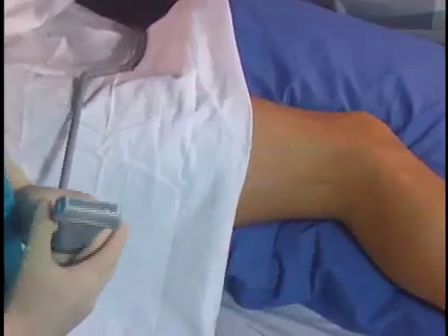A lateral position gives you good control of the patient's airway if you sedate them, as well as good ergonomics to do the block. Here we have our patient positioned laterally with a pillow between the legs for comfort.